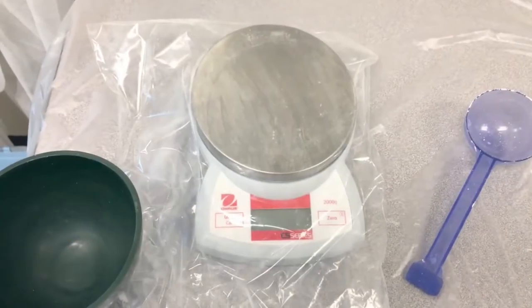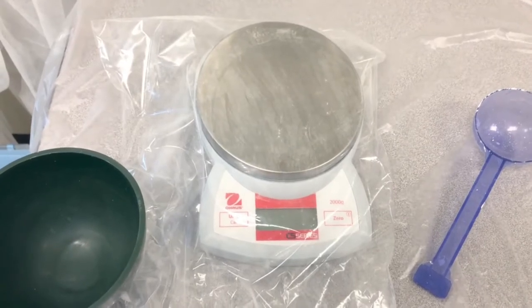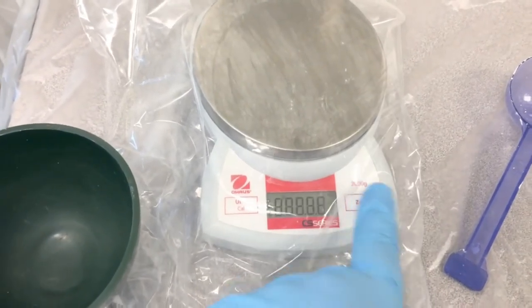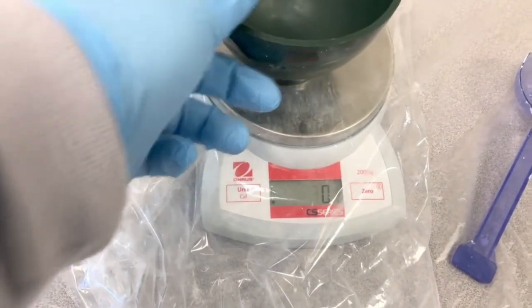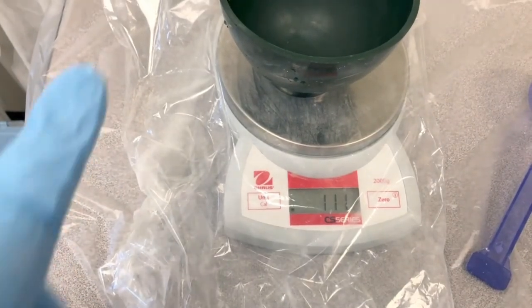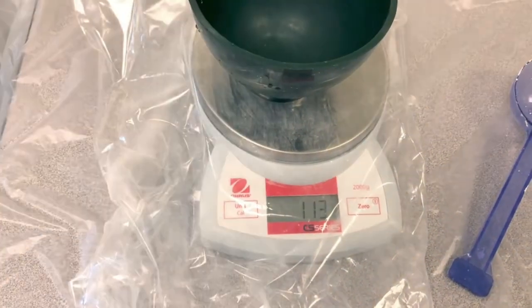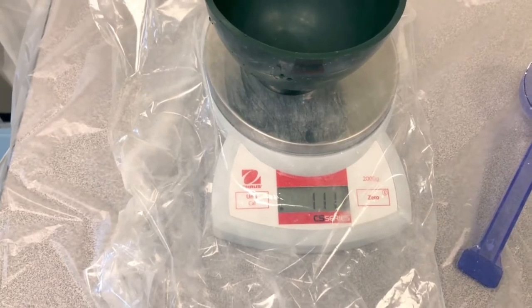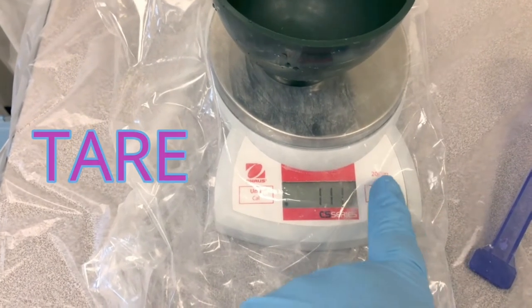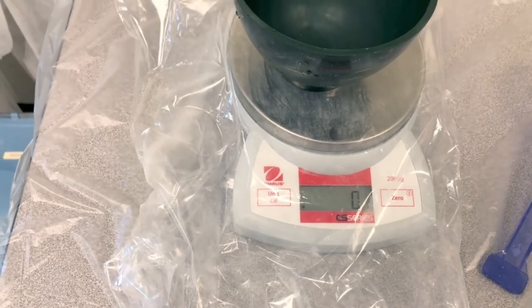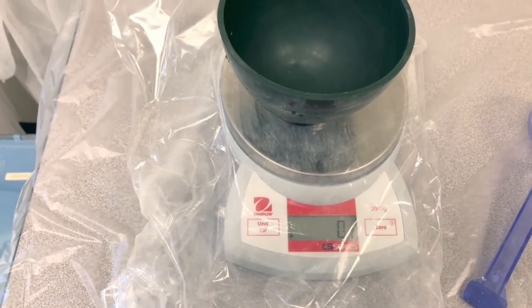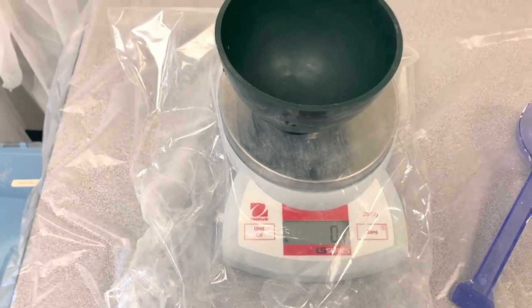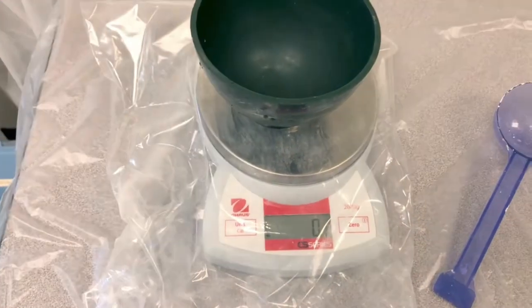Pour this into your mixing bowl. Next we'll measure out the powder. Turn on your scale if it's off and put your bowl on top of the scale. The scale will record the weight of the bowl, so we need to zero this out or tare the scale. Hit zero again to have your scale go back to zero.